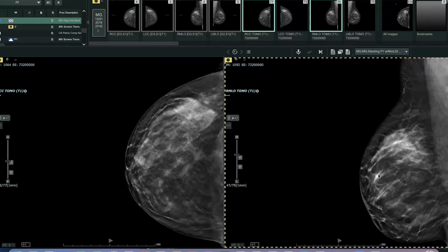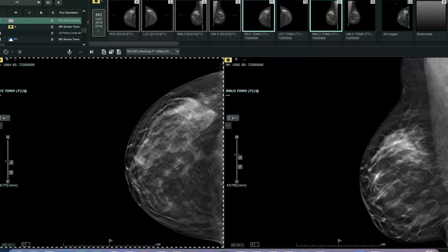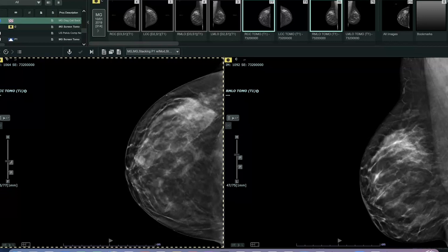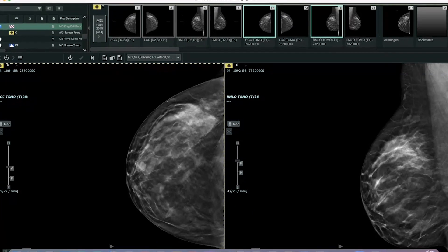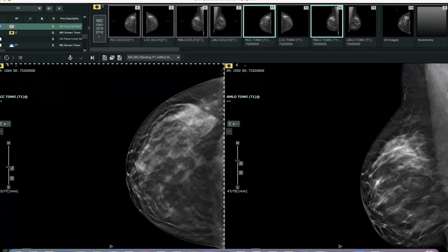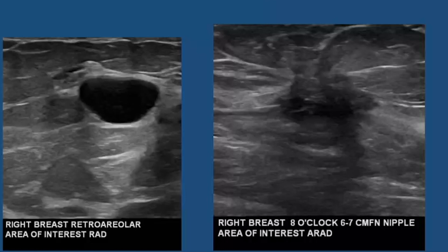This patient was brought back from her screening mammogram. She had additional diagnostic mammogram images to allow us to further compress the areas of concern. The areas did persist on her diagnostic mammogram, so the patient went on to ultrasound. On ultrasound, right behind the nipple, we see a simple cyst.